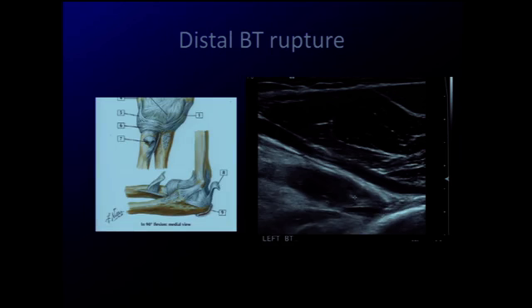Now in this case, patient presents with anterior elbow pain. Just to show you on this Netter diagram, here is that tendon coming down and inserting medially along the radial tuberosity. Because it inserts medially, it may assist you in your evaluation to have the patient supinate their arm to bring that edge out.